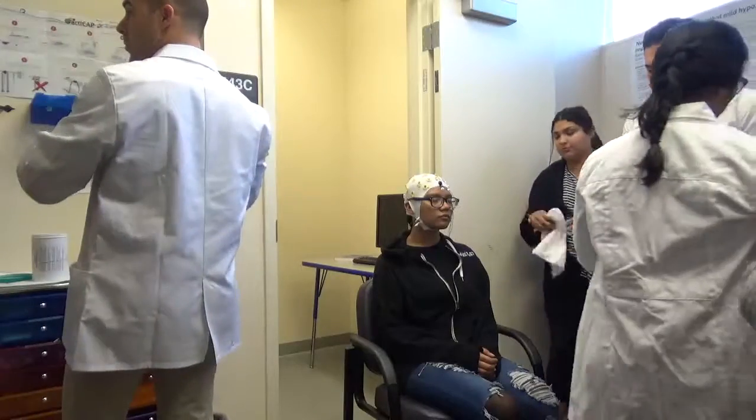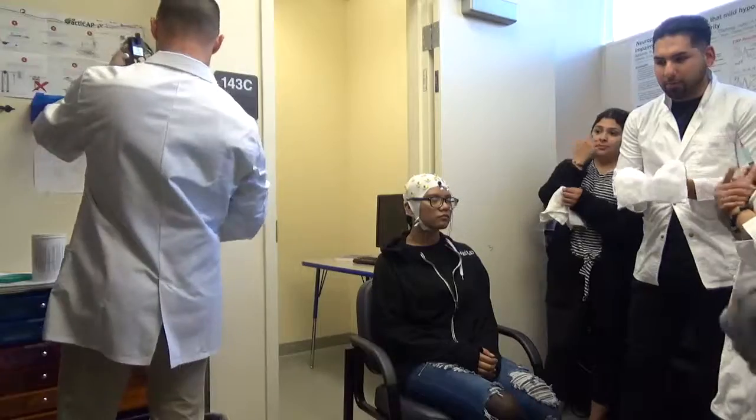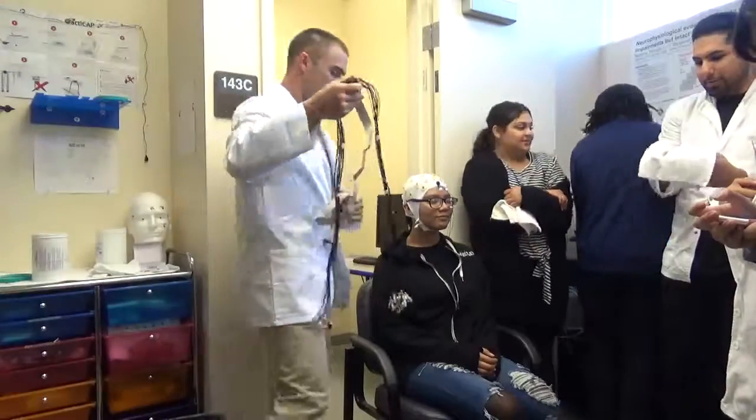Alex, do you know how to set up the computer? Could you set that up? Sure. Alright. Excuse me, people. Alex. Hey, what's up? How you doing? I'm good, how are you? You look fabulous.